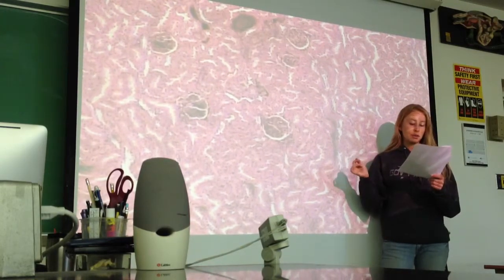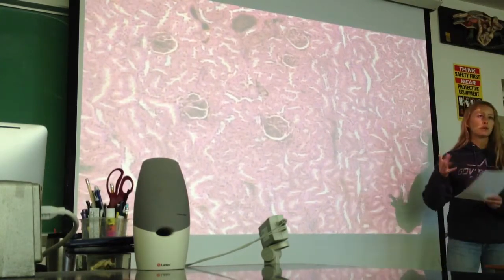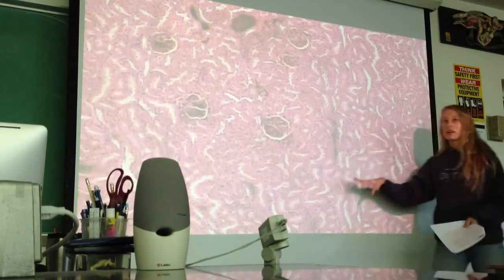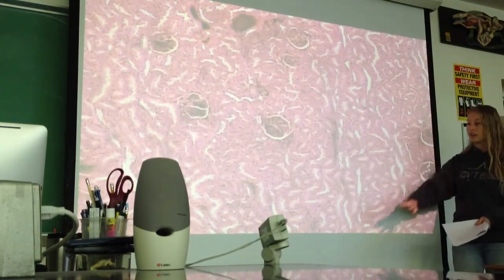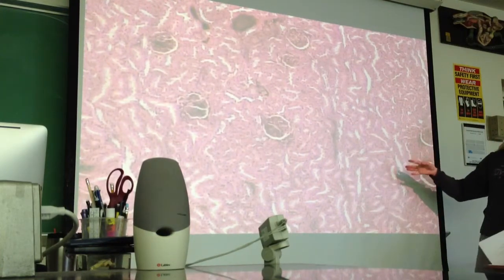Again, just remember that that's how you tell the difference between the cortex and the medulla, because you would have to identify this area here as the cortex, and the other area that we were just looking at as the medulla. I'll go back to the medulla so you can see it for comparison's sake.